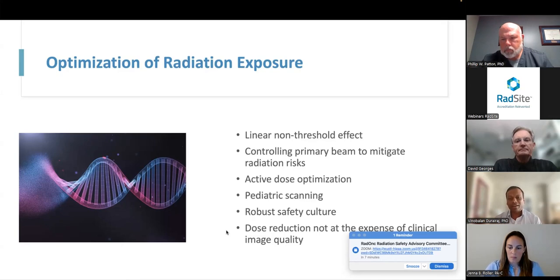So we agree that ConeBeam CT scanners, due to the technological advancements, have a drastic difference in radiation exposures. Obviously, we tend to take a step back when it comes to safety. Rightly, as Dr. Patton said initially, that is a big concern: are we taking CBCT scanners lightly? So the crux of the discussions we had today is: do not take the radiation lightly, and do not compromise anything on the image quality. That's the essence of all the discussions that we had today, I think.